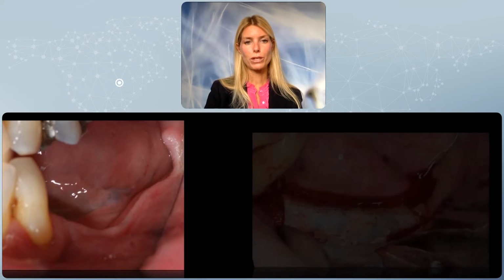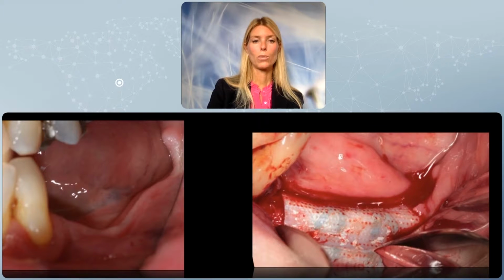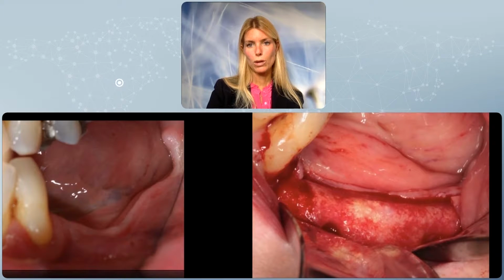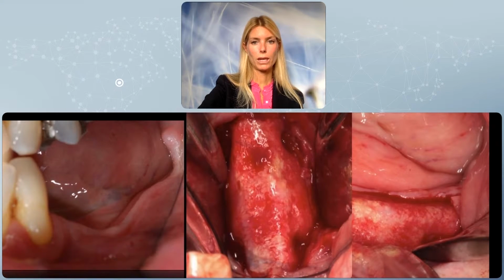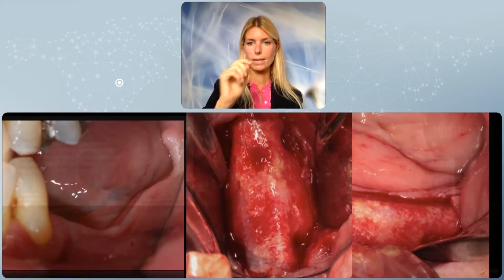Kay is another patient that was referred to me for a previously failed posterior set of implants. As you see, the patient was presenting with a very thin, narrow ridge with only 1 millimeter of keratinized tissue on top of the ridge with a vertical component. The regeneration was performed, and 9 months later, we were able to regenerate a beautiful, large, wide volume of bone where implants could be easily positioned. And I would like to highlight the vascularity of this regenerated bone, which is highly important.